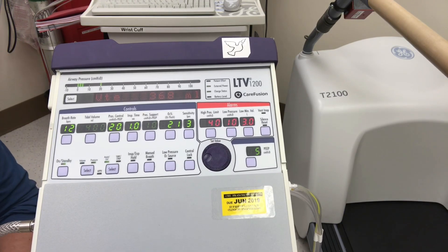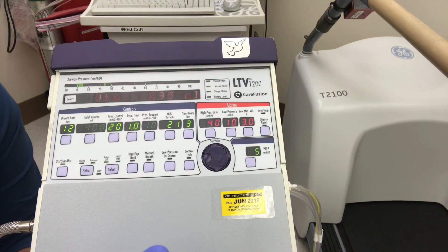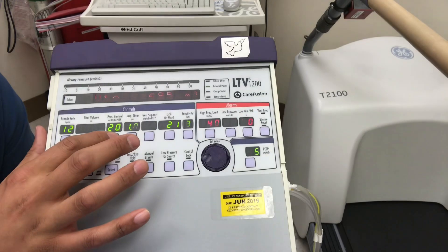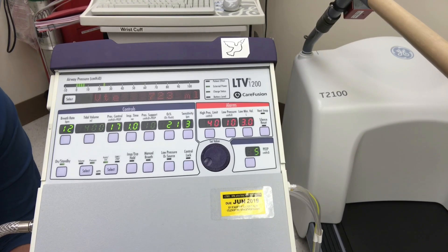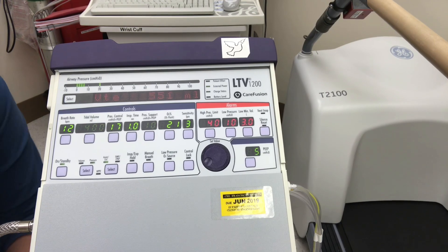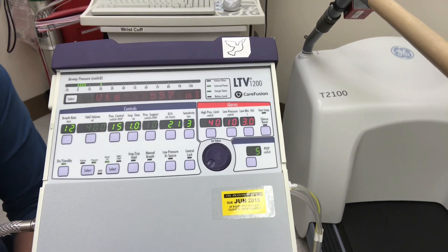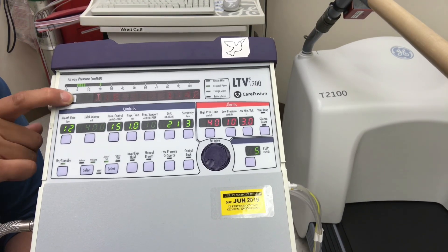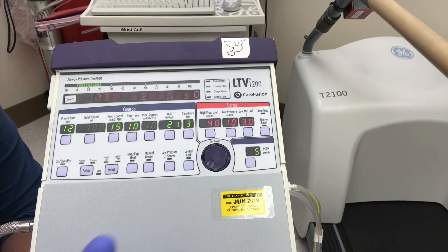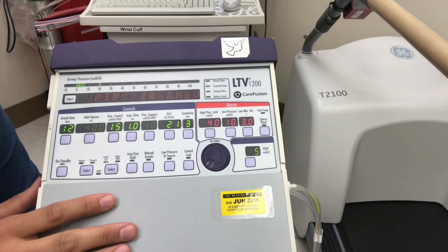Adjust the pressure control up to get an appropriate tidal volume and watch the tidal volumes increase — now 698, that's a little too big. Let's go back down to 17. Say the doctor targets 500 mls — at 17 we're about 515, go a little lower, hitting our target around 432. Then we can check peak inspiratory pressures to make sure we're not injuring the lungs — it's 20 cmH2O, manageable, looks good.